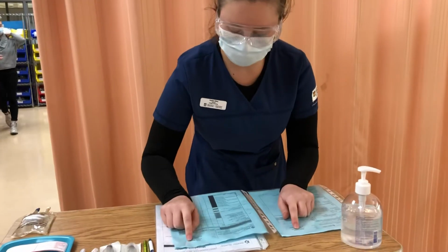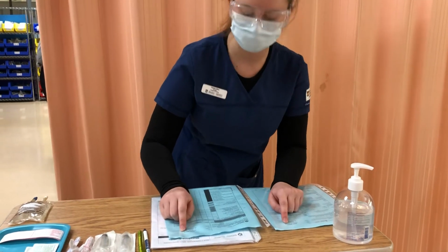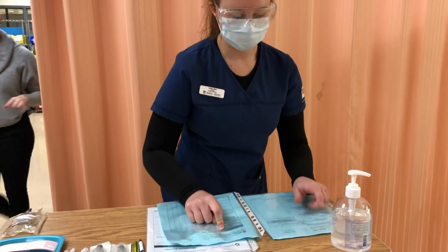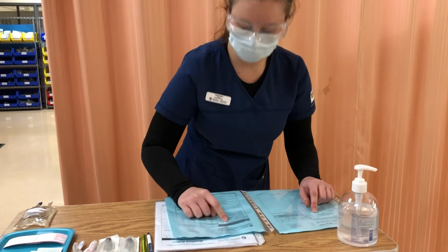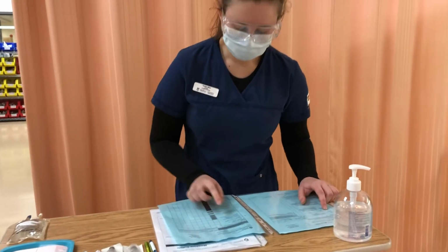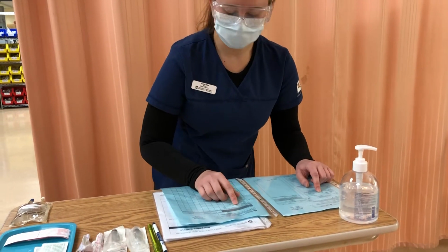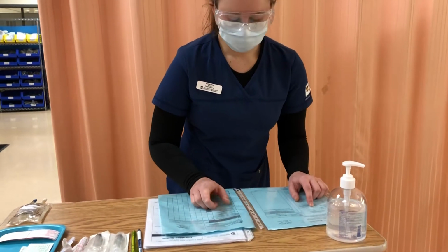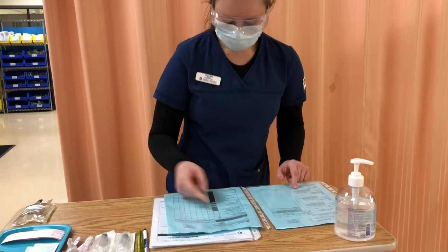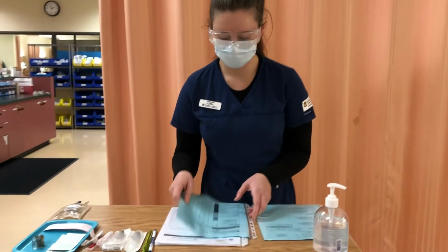So this is for Marcy Paris, 55 years old, no allergies. So this is being prepared to give now. This is due now. This is the PCA order form. This is morphine, 1 milligram per milliliter, PCA dose of 1 milligram, lockout interval of 5 minutes. The physician has signed this, and the transcribing nurses have signed this, and this is to be given now. So these are all exactly the same.